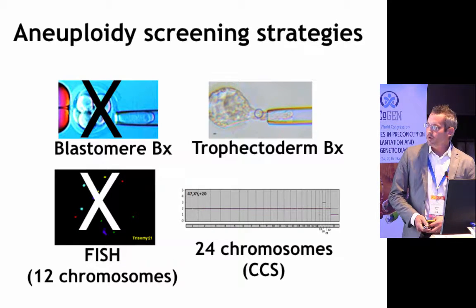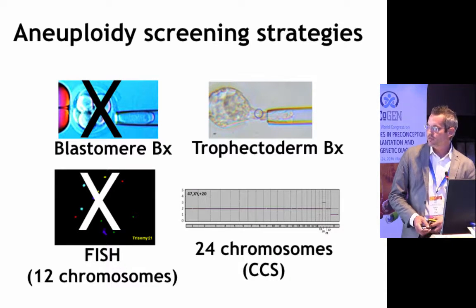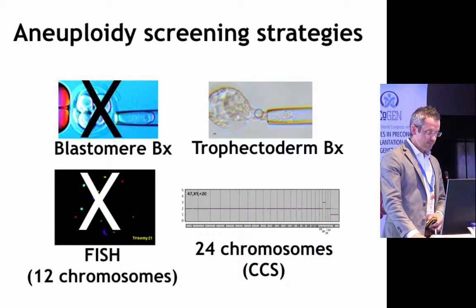Obviously, we've been moving away from blastomere biopsy and fluorescence in situ hybridization to trophectoderm biopsy and comprehensive chromosome screening methods, which are what I'm going to be talking about today.